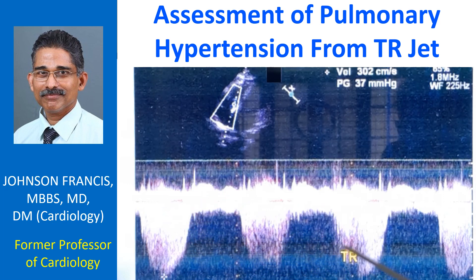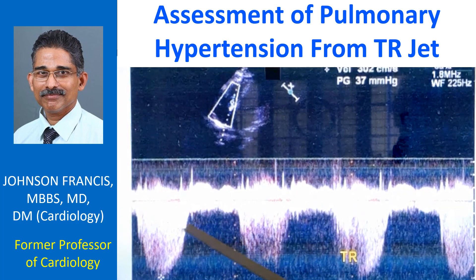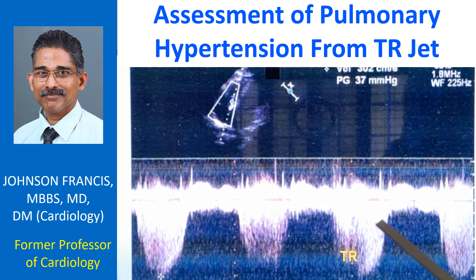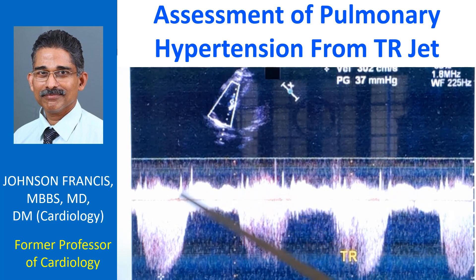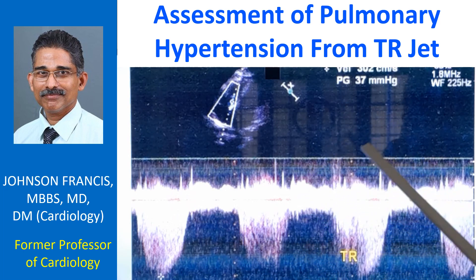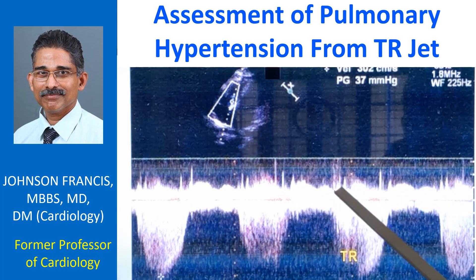This is an incomplete jet. This is also incomplete. This is a good jet. The change in density could be because of variation in the tricuspid regurgitation volume in different phases of respiration. In inspiration, the volume will be more and you will get a dense jet. There could also be changes because the position of the cursor with respect to the tricuspid valve could also change — that could be another reason for differences in the intensity of the jets.